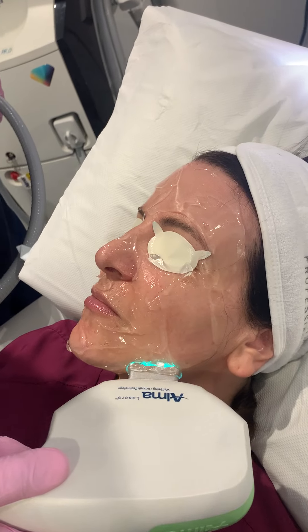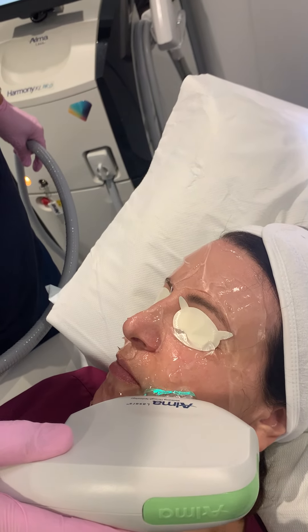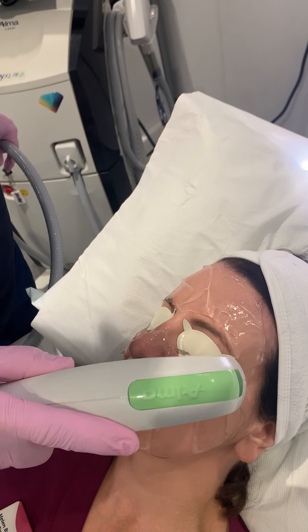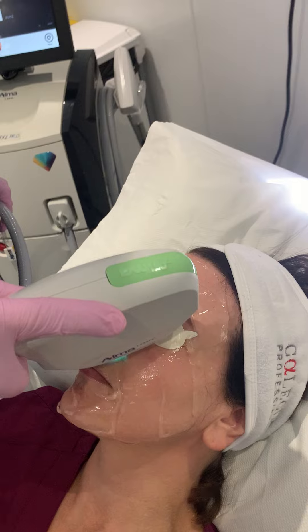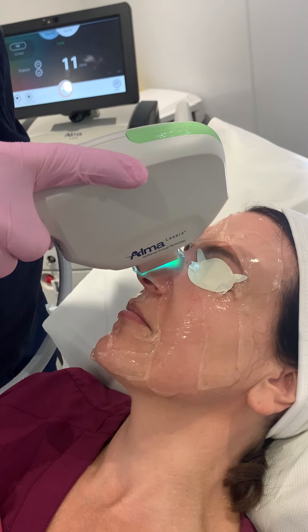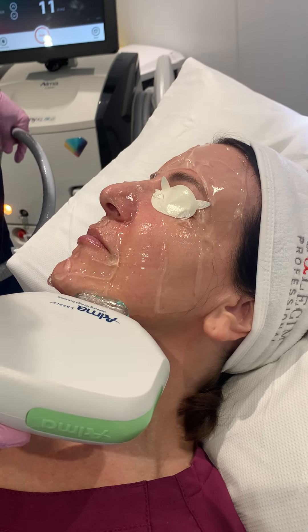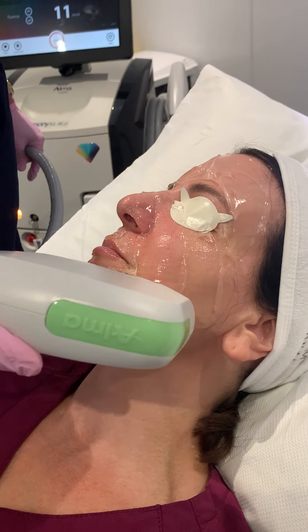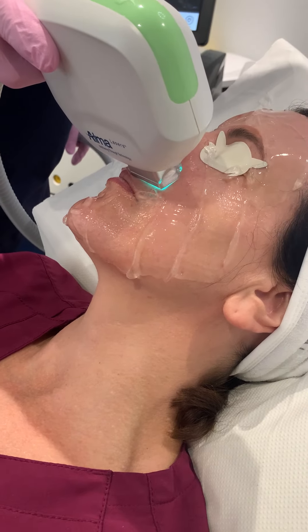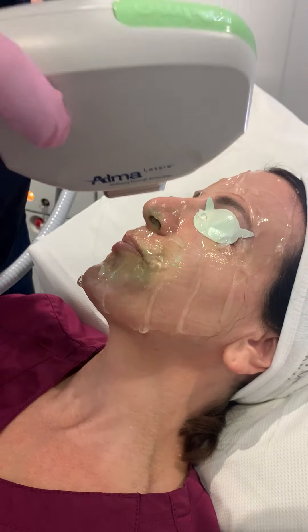There's quite a lot of energy going into the skin here. What's actually happening is that green light is hitting the redness in her skin, in the blood vessels, and it is cooking. And as it cooks, we end up always a little bit tender around.